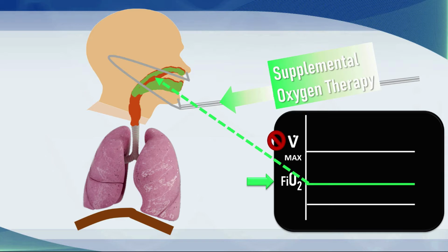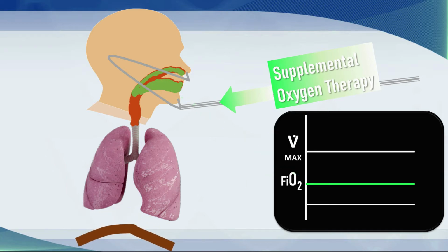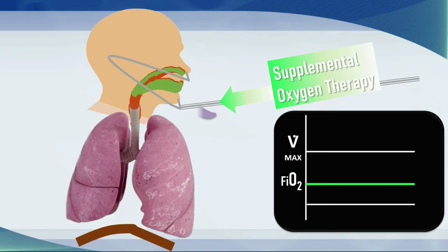Now, when the patient initiates a breath and oxygen-enriched air enters the airways, we have a combination of 3 things. We have the fresh gas flow, we have the air coming from the nasopharynx that is blended in with the fresh gas flow, and we have air being entrained from the space outside. This is sometimes called room air. Three different things: fresh gas flow, supplemental oxygen in the nasopharynx, and entrained air. And that all blends together.